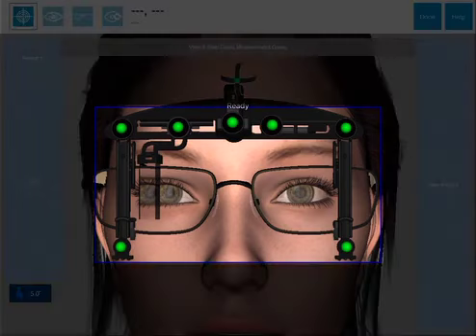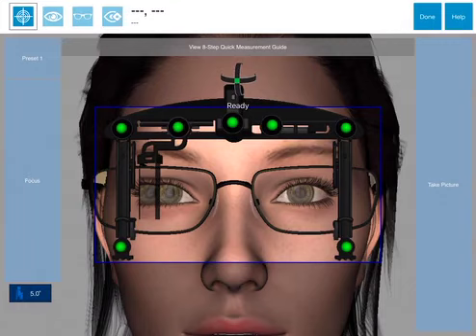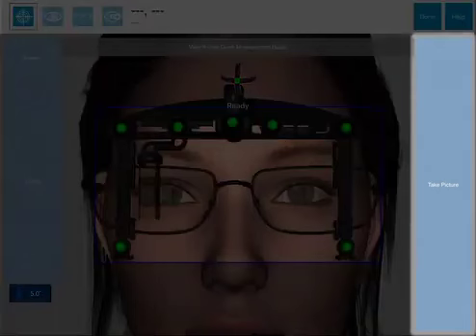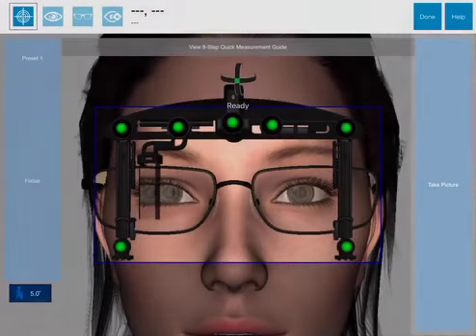Ensure that all the green OPD sensors are fully visible within the blue rectangle and ask the customer to look directly at the iPad camera lens and wait for the flash. Touch the Take Picture button while making sure that the iPad is held still.